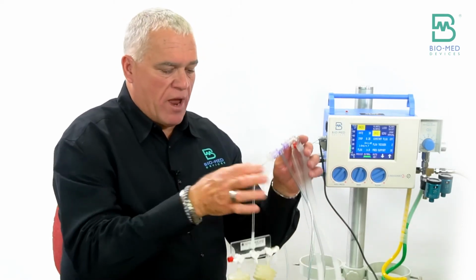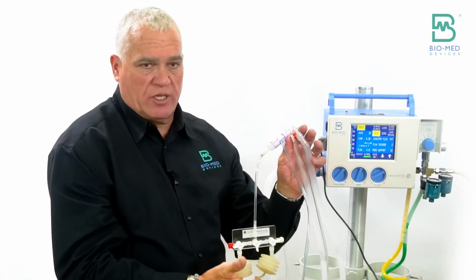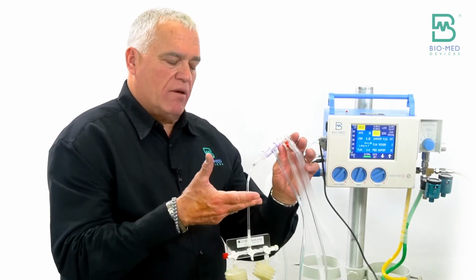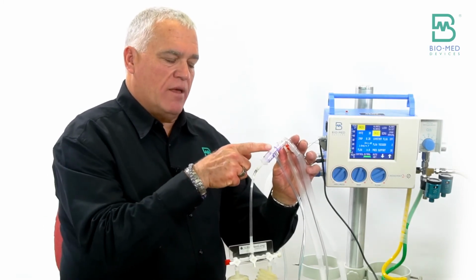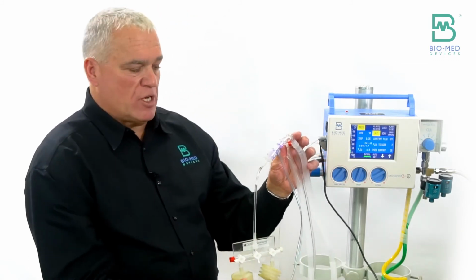If there's a leak around the ET tube here and I send gas to the patient, some of that gas leaks away, the patient doesn't get it. If the patient exhales and on the way back it leaks around the ET tube, then I can't measure it with the sensor. So in that case, the patient got the gas, but we can't measure it.